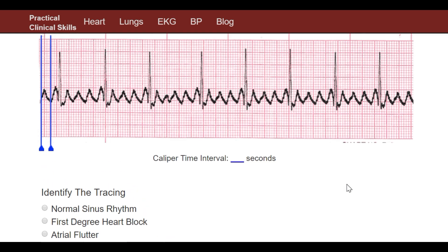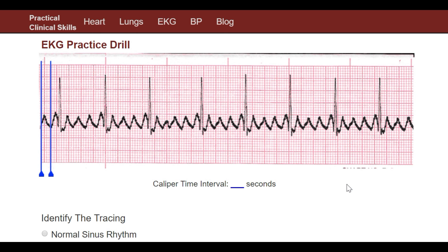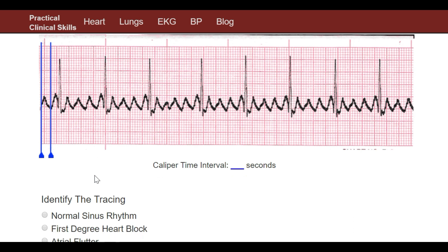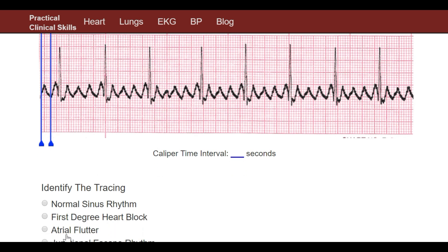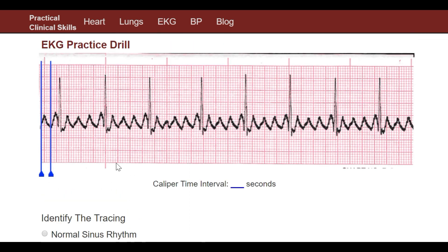I'm not going to go through the whole run-through of how to measure it, because this isn't one of those rhythms that you have to go through the measurement to figure out — you can just look at it and tell. This is classic atrial flutter. It's fluttering everywhere and it has a sawtooth shape to it.